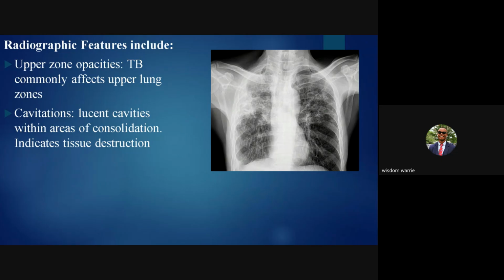All right, thank you. Has your question been answered? Yes. All right, we have one more person as the last question for today. We have Millicent Ukamaka. Please, Millicent, unmute yourself and ask your question. Okay, sorry, please, can you throw more light on that interstitial pattern? I did not get it at that point you were explaining it. So I don't know if you can throw more light on it.